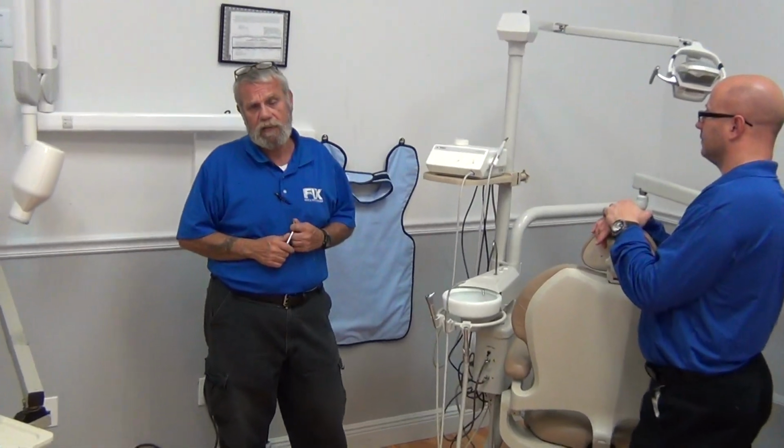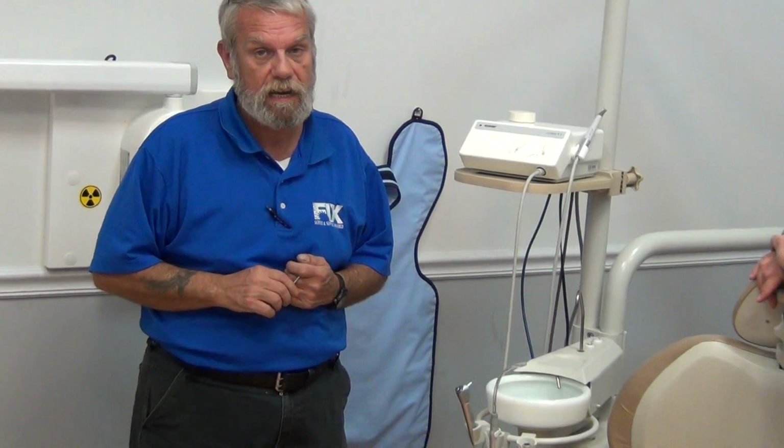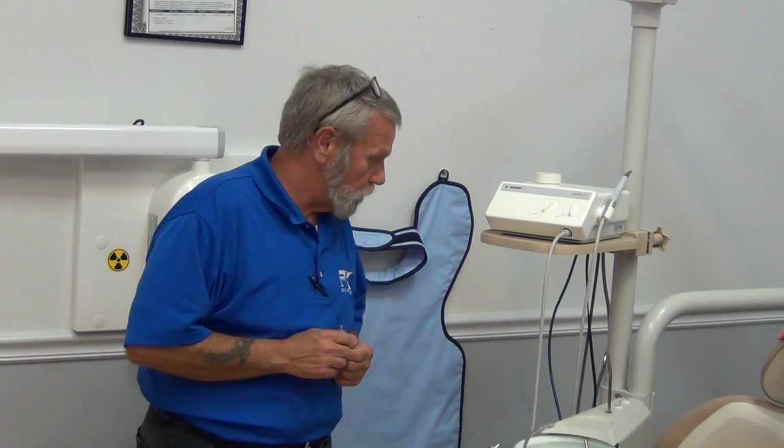One word about Prophy jets. They depend completely on clean air. If the doctor's air has been compromised, or if the powder's been compromised, meaning the powder's gotten damp, it is not going to work. It takes dry, clean air, and it takes dry, clean powder. Let's look at a few complaints.